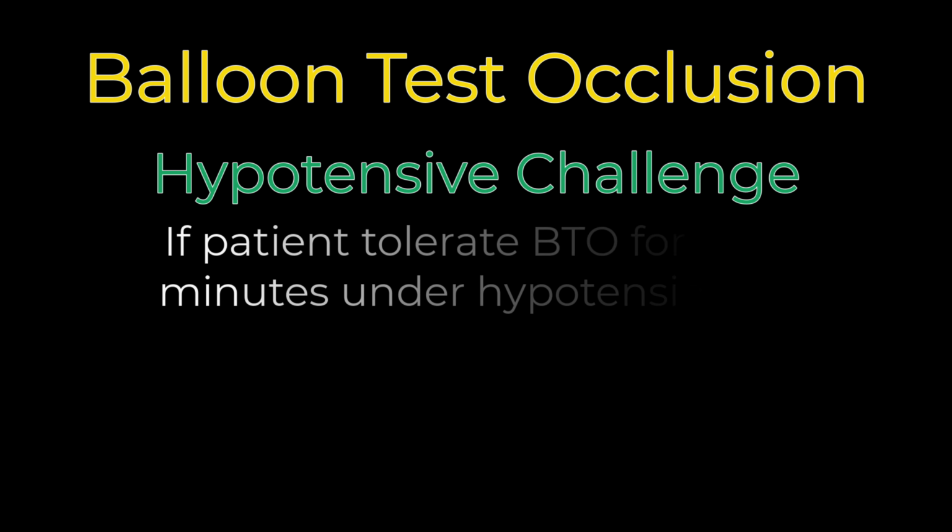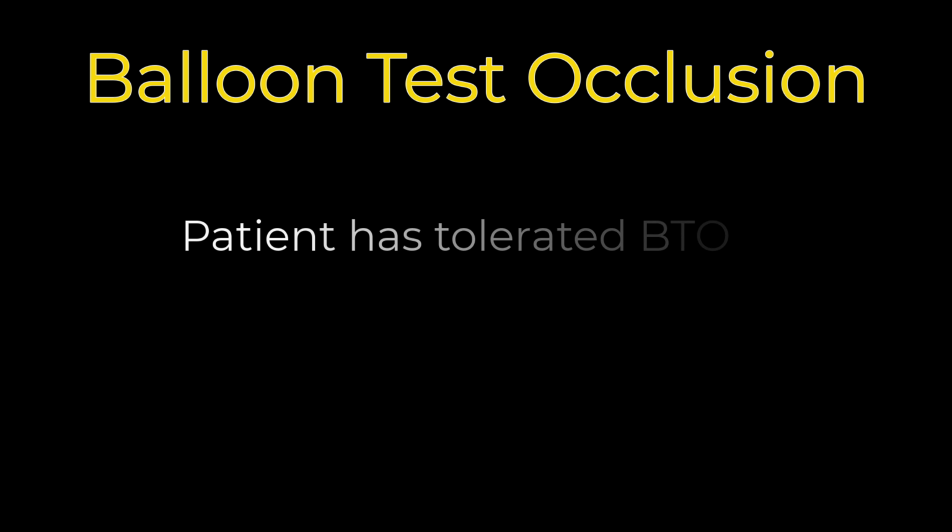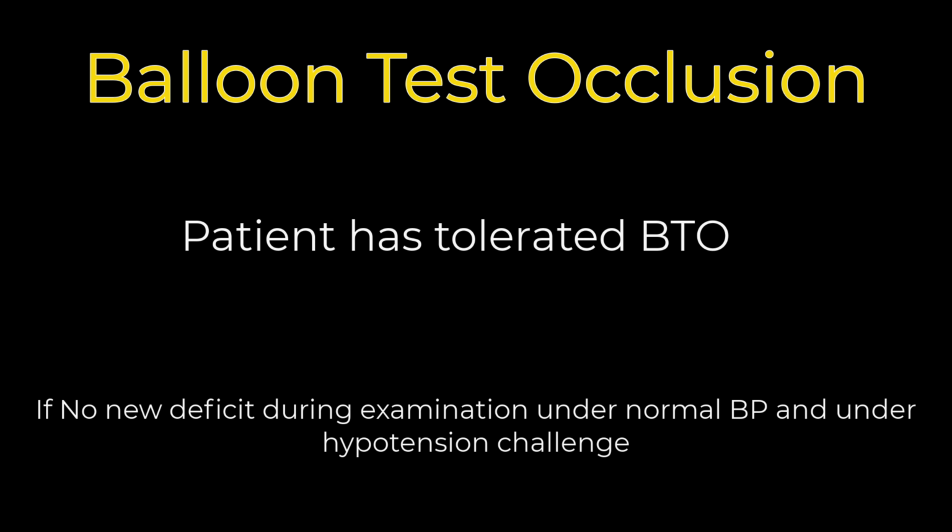If the patient tolerates the balloon occlusion for another 20 minutes under hypotensive challenge, and if there is no clinical deterioration during the hypotensive challenge, we consider that the patient has tolerated the balloon test occlusion and we go ahead with the parent vessel occlusion.